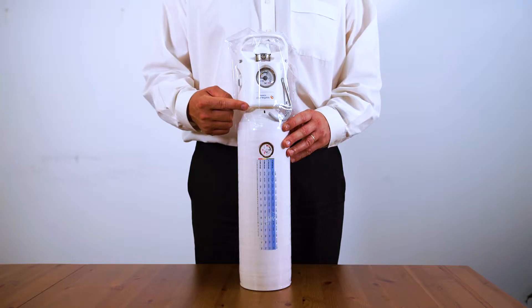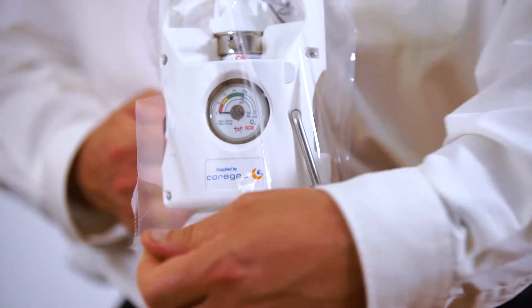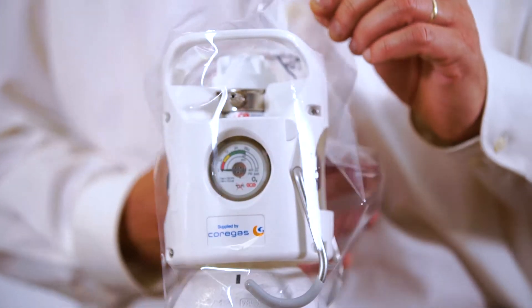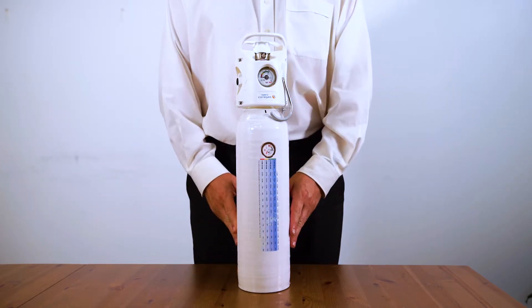The Coregas C IVR is supplied with a tamper evidence seal over the entire guard of the cylinder. Simply tear the seal off and discard it thoughtfully.